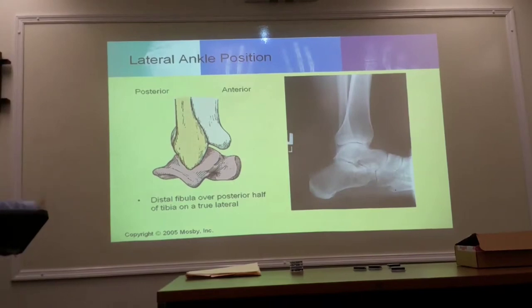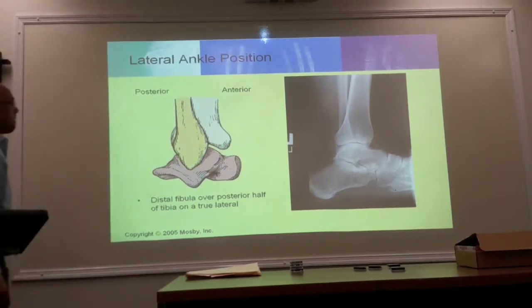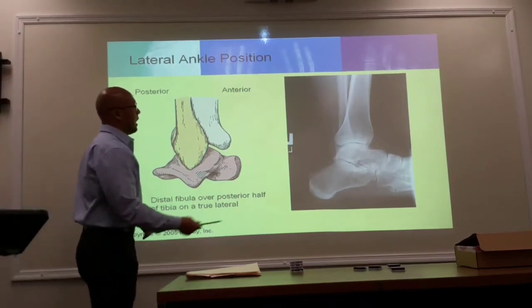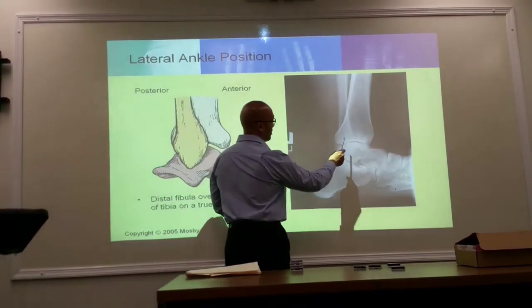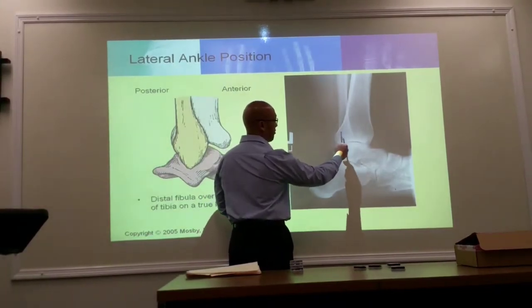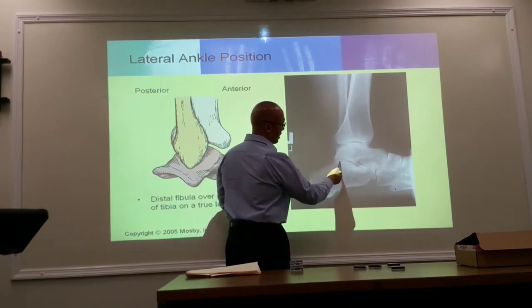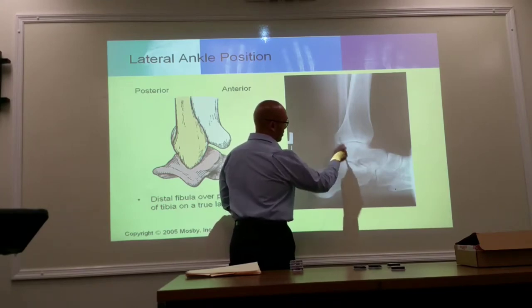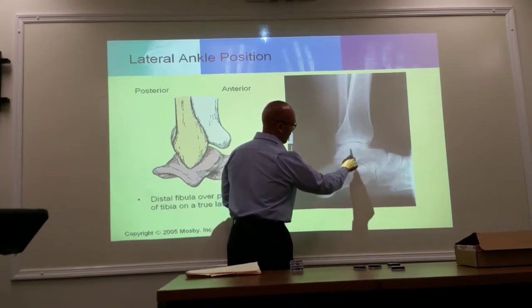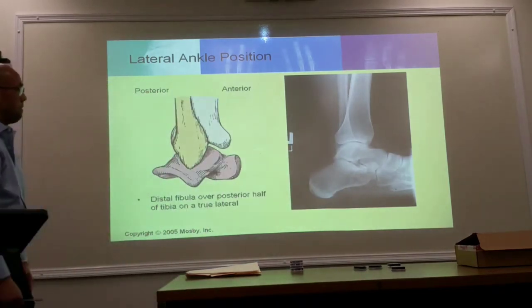Lateral projection of the ankle. As we said previously, the fibula is going to be superimposed with the posterior part of the tibia. So there's superimposition here, and the fibula will also project lower. Can you guys see the shadow of the fibula? Here's your tibia, and here's your fibula right here. It projects slightly lower.